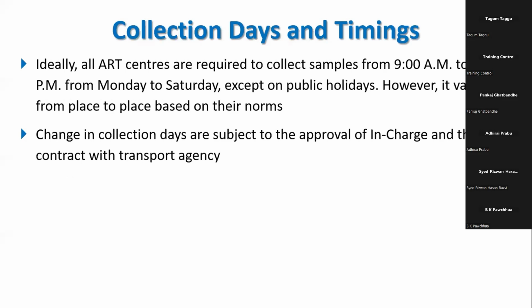arrange for the transportation, or store the blood in the refrigerator. The plasma, sorry, not the blood. So the plasma can be stored in the refrigerator, that is 2 to 8 degrees, not the freezer compartment, the fridge compartment. There you can store the plasma sample for 5 days.